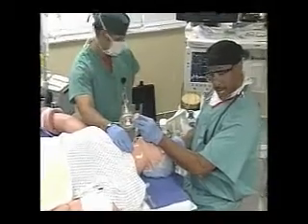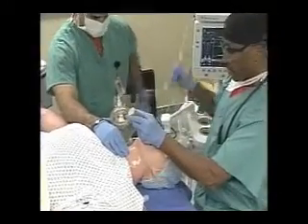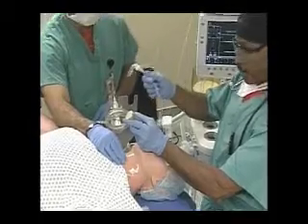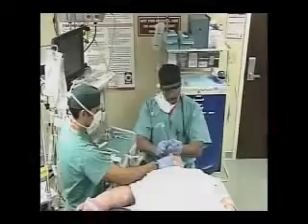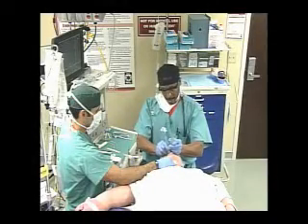Once you have good visualization of the cords, you take your ET tube, slide it in from the right, maintaining the good view of the cords. Do not block your cords with your tube. And then you slide in your ET tube.